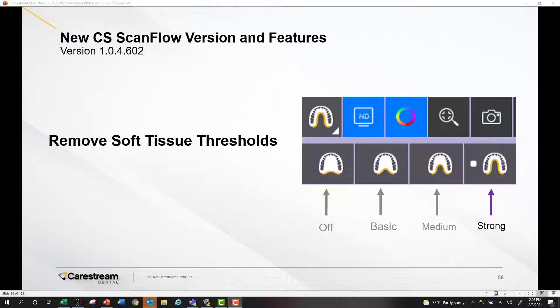In previous versions of ScanFlow, there was an option in the preferences to either turn this on or off — basically just a toggle, either more aggressive in removing soft tissue or off. Now we've actually added the feature as part of the actual scanning feature set, so you don't have to go into the preferences, making it easier to access.